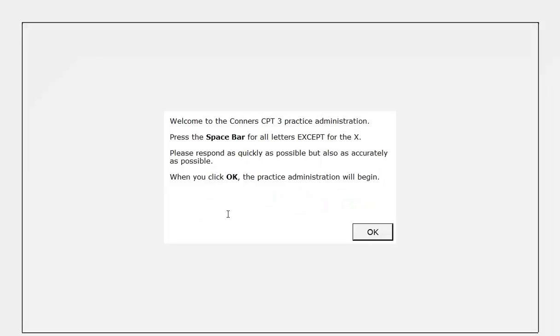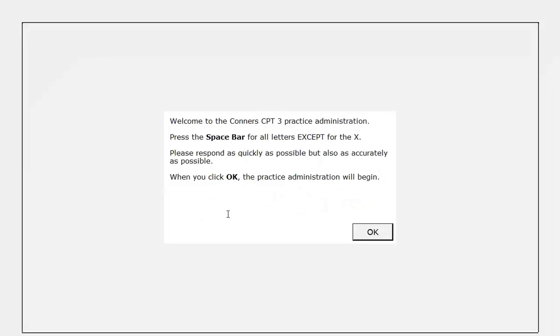Once the instructions are read, it is time to begin the practice test, which runs for approximately one minute. During the practice test, the administrator should observe the respondent carefully. The administrator is responsible for deciding whether the respondent is ready for the actual administration or should practice again. However, the software will provide guidance to help inform this decision.